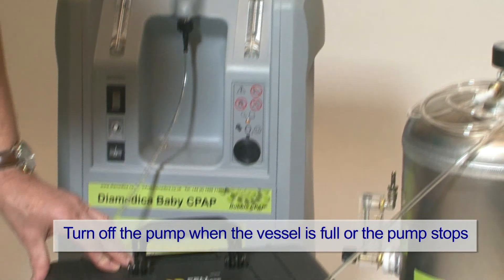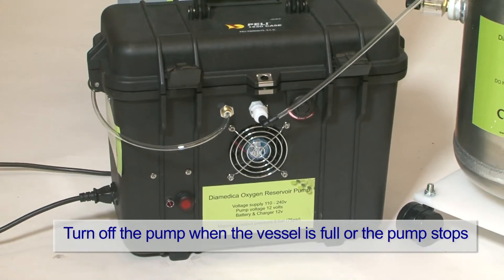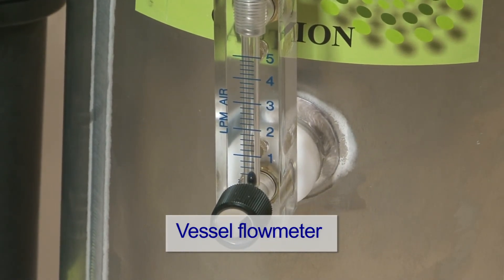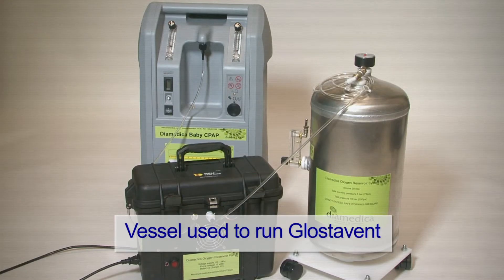Turn off the pump when the vessel is full or the pump stops. The flow meter on the vessel can be used to supply oxygen to the patient using suitable nasal cannula or mask. The oxygen in the vessel can also be used as a drive gas for the Glostervent.